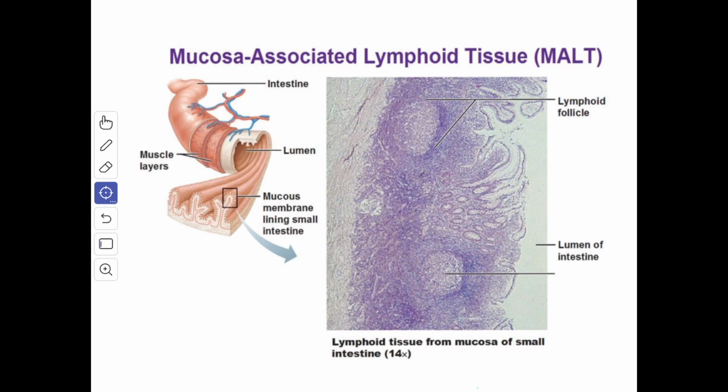The larger aggregations extend into the submucosa, and individual lymphocytes may infiltrate the epithelium and pass into the lumen. The aggregations are not surrounded by a capsule, nor do they have connective tissue septa. A supporting network of reticular fibers is present. As a rule, these masses of lymphoid tissue do not receive afferent lymph vessels and have no lymph sinuses. They do not serve as a filter of lymph.